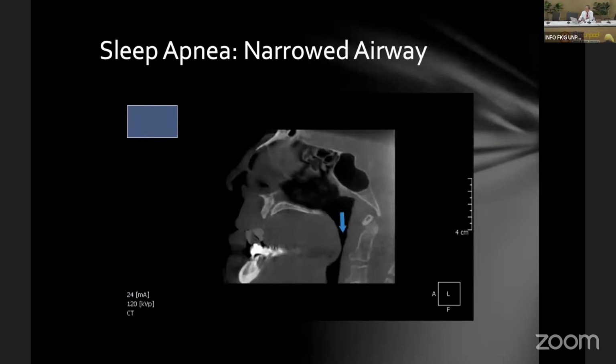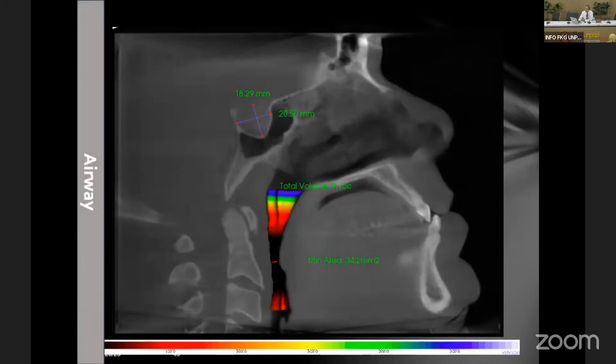Like this one, you see there's a potential narrowing here. Although we cannot say definitely that this patient has sleep apnea, there is an indication of possible sleep apnea. Also, we can do the measurement with software. Many software packages can do the measurement now.